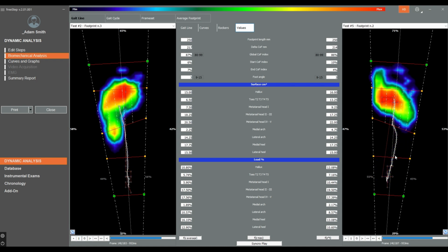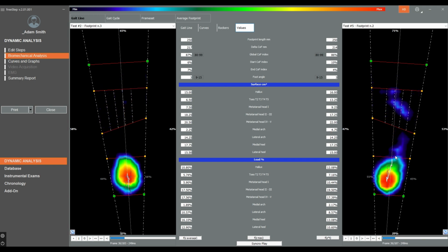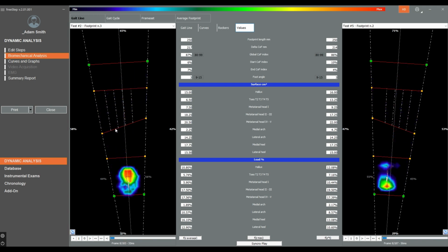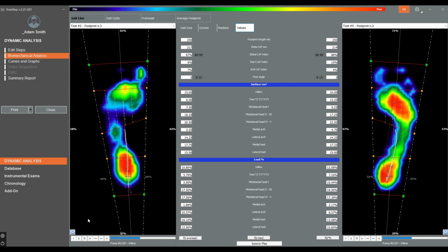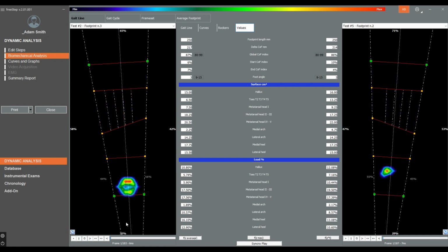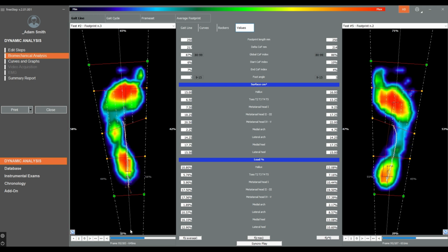And that's very interesting, because if you look at this gentleman's x-ray report from the hospital, he has a heel spur. And so this person has been diagnosed with bilateral plantar fasciitis, with some metatarsalgia on the left. So this is showing it perfectly. And I would say probably if you look at his big toes, slow it down again, probably he's also got a little bit of hallux rigidus. I think he's in his early 60s, so he definitely needs some orthotics and some work through those feet, as well as balancing pelvis and everything above.